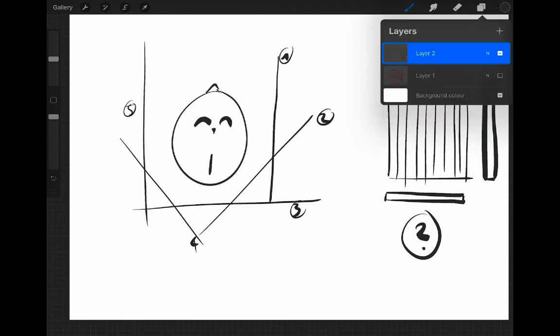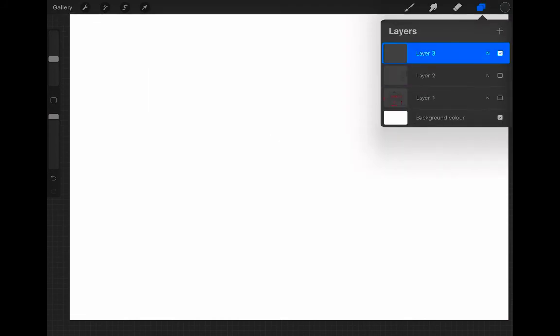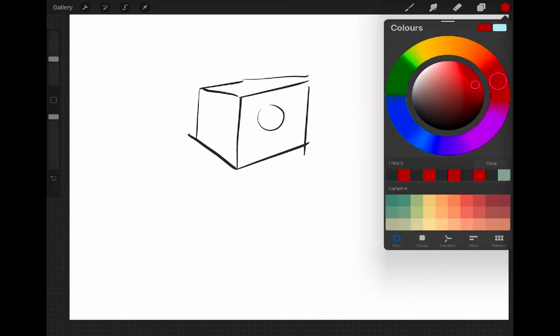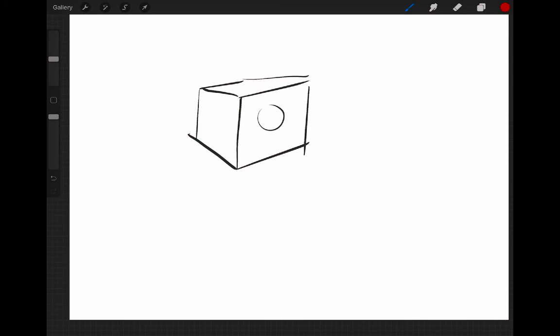Then, if you are happy with this idea in 2D, and don't worry if you're not, we can talk about it in a little while. Imagine what the situation looks like when you're doing this in 3D, right? Now we have an image embedded in here, and let's imagine we want to take a projection that's in this particular orientation, over there. What does this mean in terms of MATLAB operations, given that we have a 3D cube of data, okay?